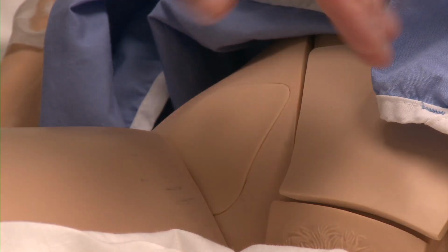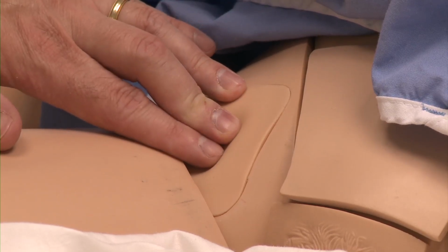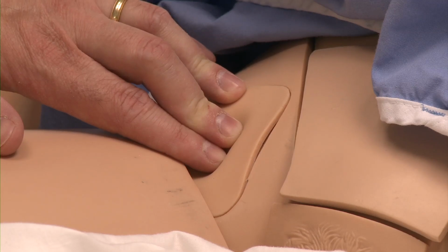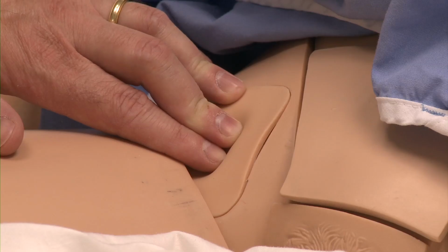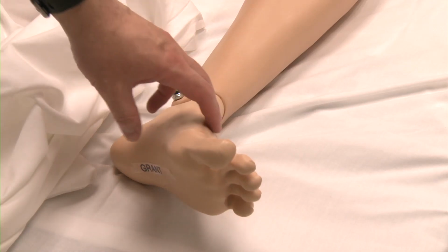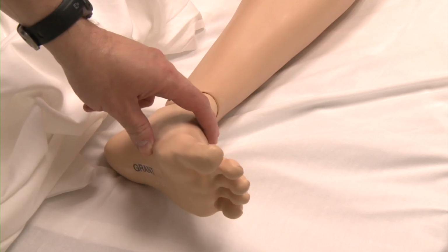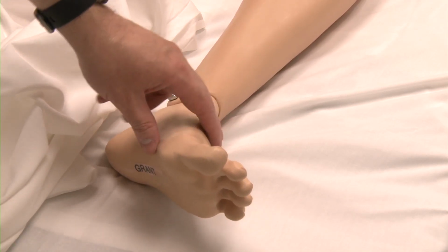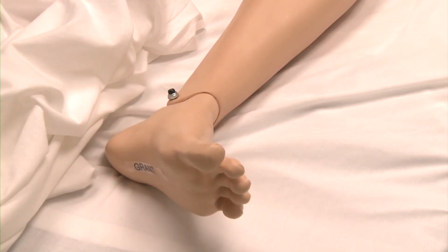Each SimMan has bilateral femoral pulses. Again, you want to locate the softer pad on the mannequin and press firmly down until you feel the pulse pulsate back at you. Some of our simulators have dorsalis pedis pulses, which when you press on the appropriate location on the top of the foot, you'll feel a pulse. However, not all of the simulators have this pulse. If you palpate the foot and do not feel a pulse, you should still tell us that you're assessing the distal pulses.